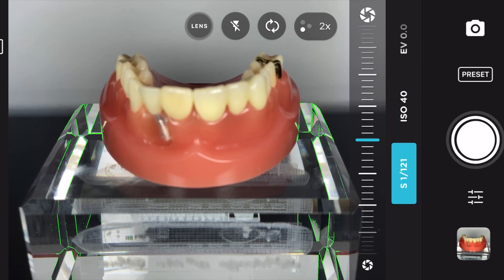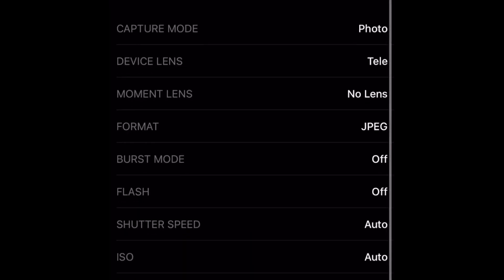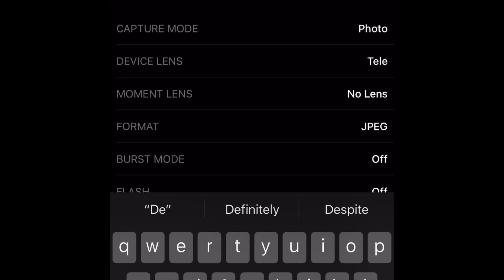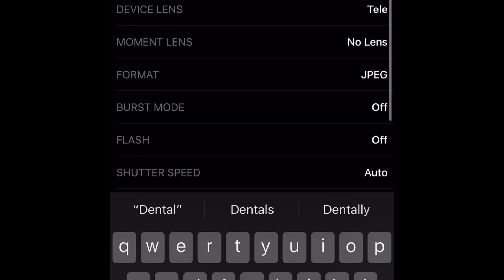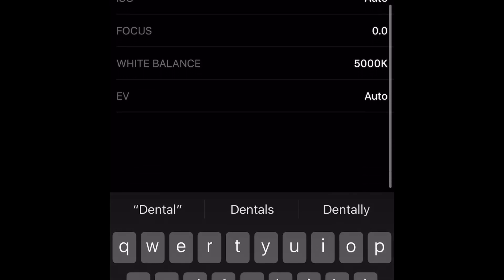You can hit the preset menu here and save all your settings as a preset. The cool thing about that is when you go back into the app, you can hit that preset button and it will auto-recall all those preferred settings for your dental photography. I think that's a wonderful feature. I'm Vu, and thank you very much for watching. I think you will have a great time shooting with the Moment app.